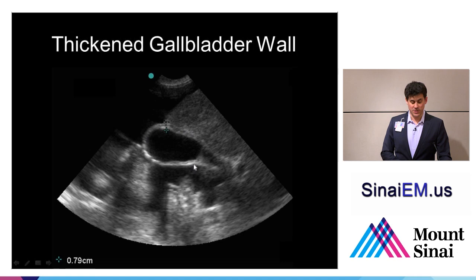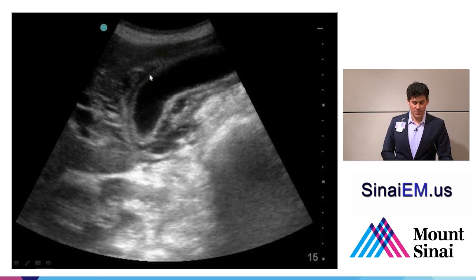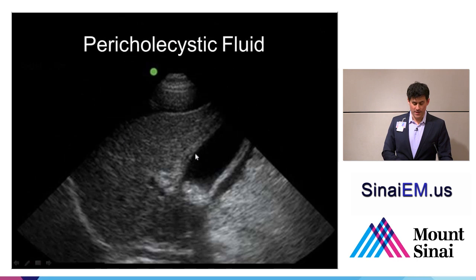Here's a thickened gallbladder wall measured at almost 8 millimeters. Unfortunately, this patient also has pericholecystic fluid — or in this case, ascites — so you really can't read the wall thickening in isolation in that setting. Here we can see advanced gangrenous cholecystitis with a very thickened gallbladder wall. Even in this advanced state of disease, with pericholecystic fluid surrounding it posteriorly and fluid intercalated into the gallbladder wall, the wall itself is still bright. And here we see cholecystitis with stones and shadowing, thickened gallbladder wall, and pericholecystic fluid.